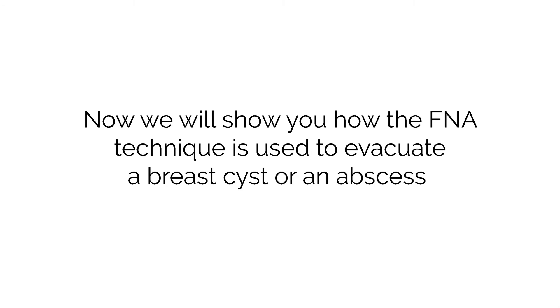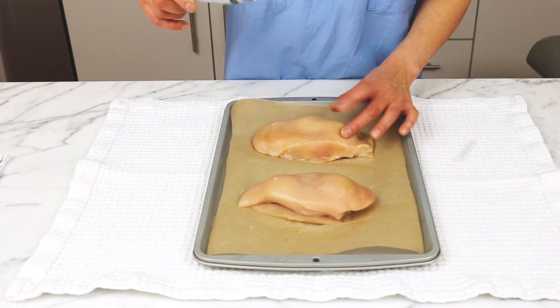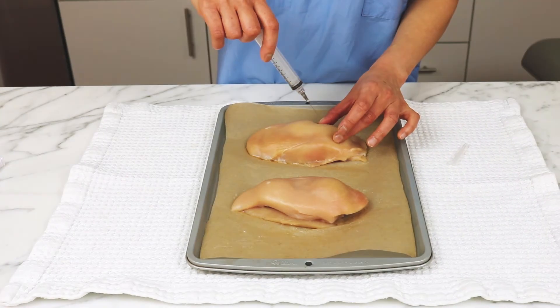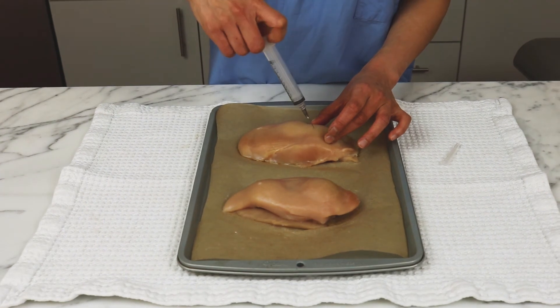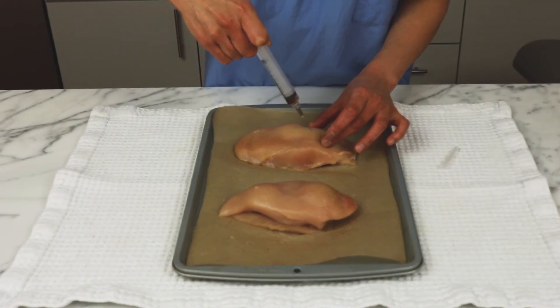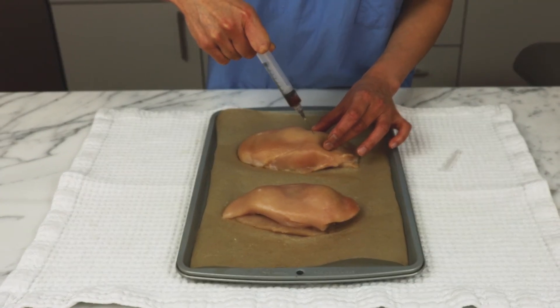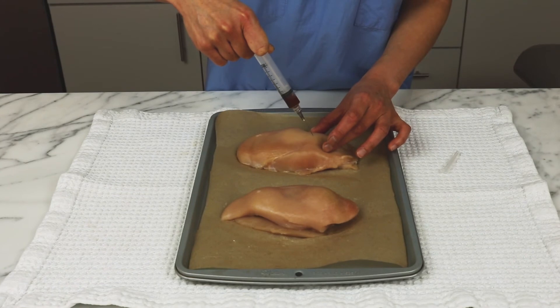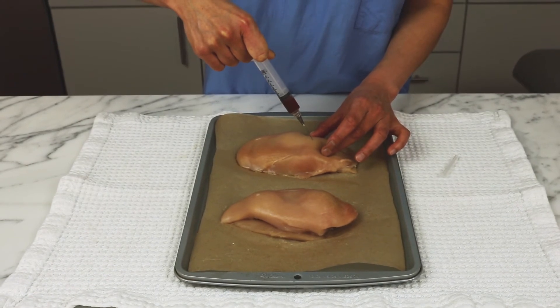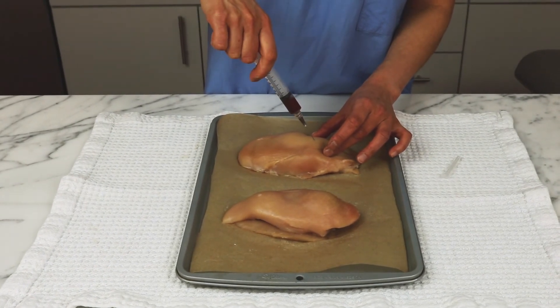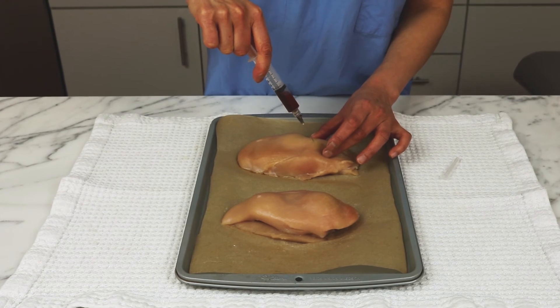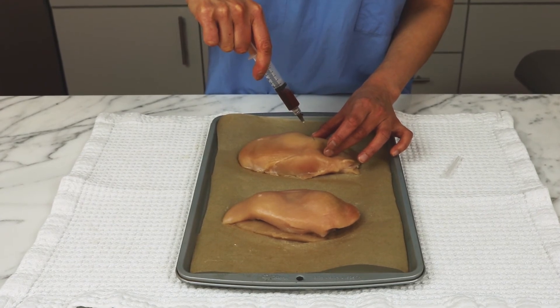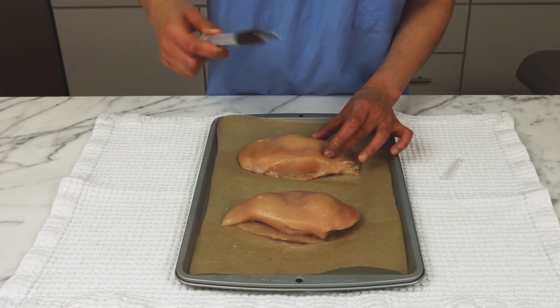Now imagine that we have done the local anesthetic already. I can feel the lesion here — I insert the needle into it and I remove the liquid. You can see that the lesion is disappearing. So if you had a cyst or an abscess, by doing this you are both treating it and diagnosing it at the same time.